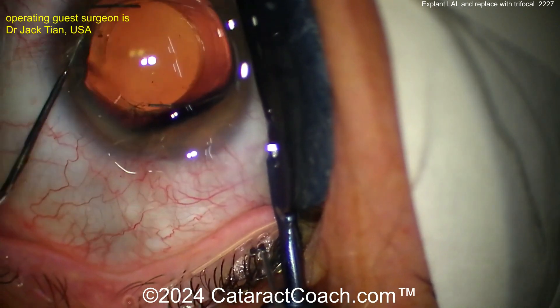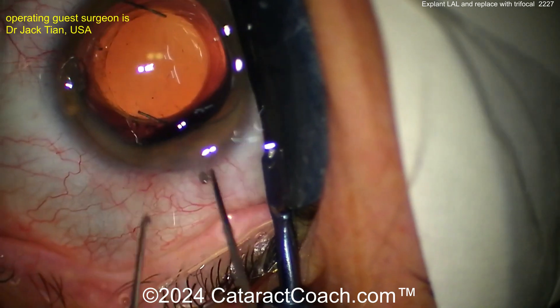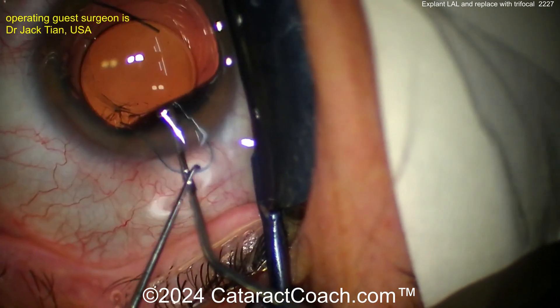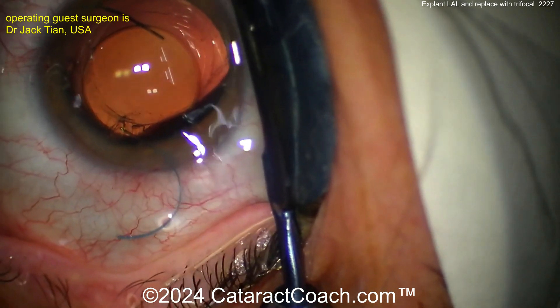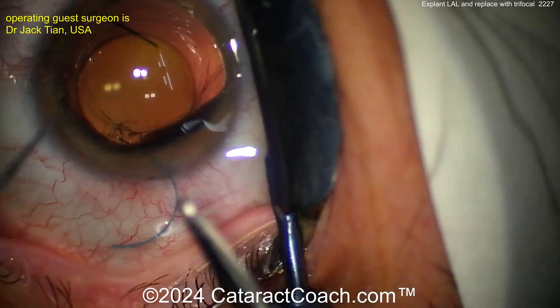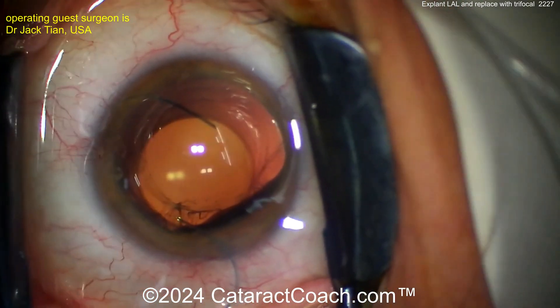Fortunately this patient has not had a YAG laser capsulotomy yet, and as a result the posterior capsule is still intact. Once you get this lens up, getting a silicone lens out of the eye has its own challenges. I like the technique here of pulling one haptic outside the eye — and you can see it already just rotated the other direction, so not a very strong hold there at the haptic-optic junction.